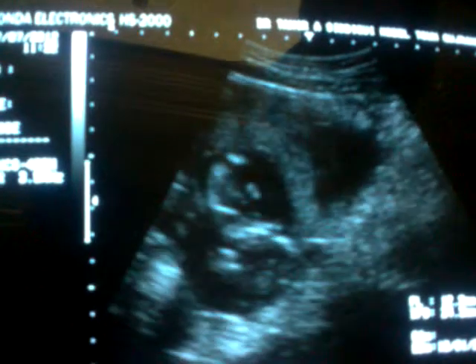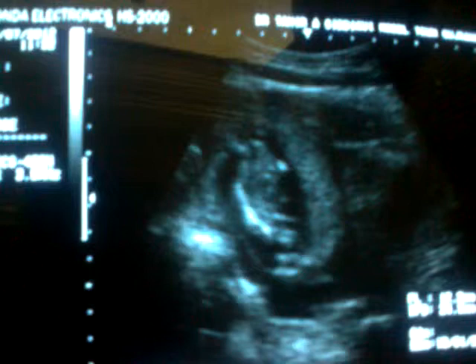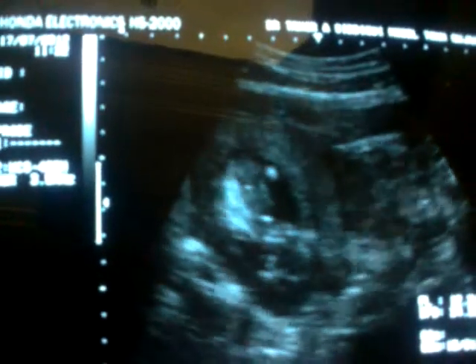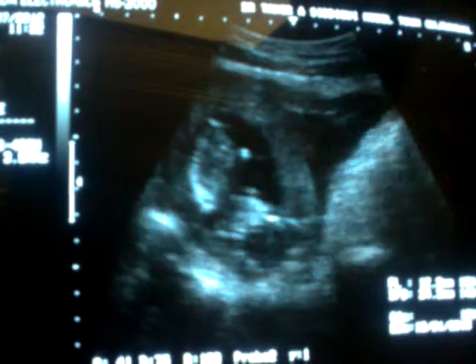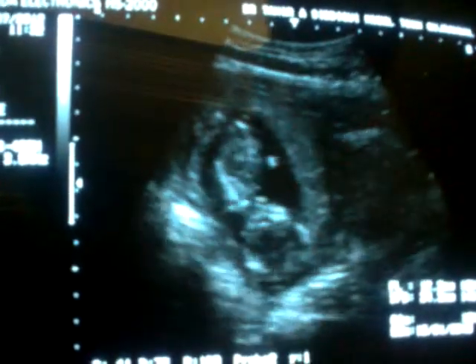any possibility of Down syndrome, though the position of the fetus is such that I am trying to get the view.